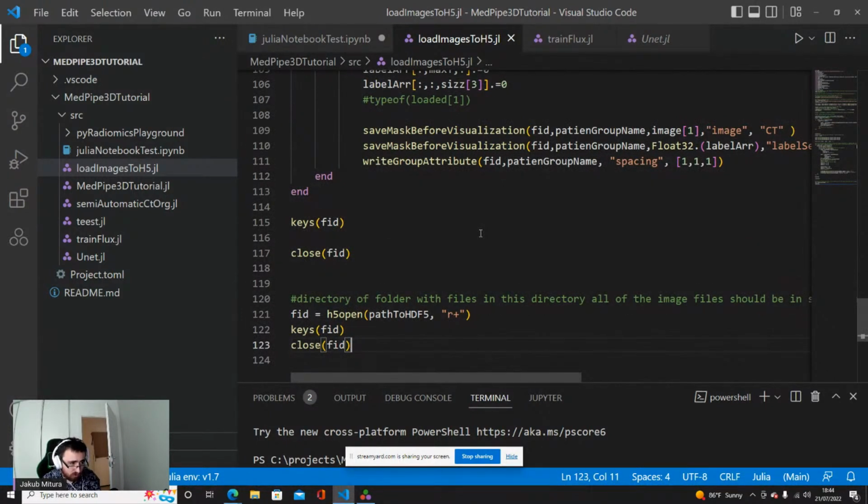What is also important, and this is one of the reasons that I want to work with Julia, is that we can do all of those processes, so augmentations, different metrics, different steps, we can make it differentiable. And if we can make it differentiable, we, at least in principle, can do it as one big optimization problem, not as a hyperparameter tuning problem that is harder, but a far more efficient optimization problem.